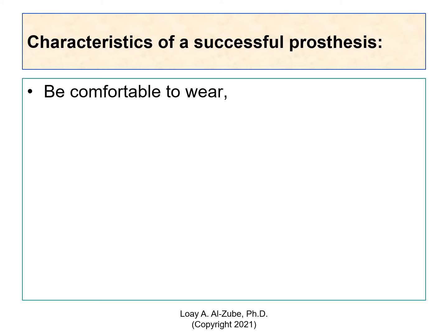And comfort is very important because it's related to pain. If the subject is feeling, without a spinal cord injury. Okay, so assessing comfort, load, pressure, it's important. Now, easy to put and remove.